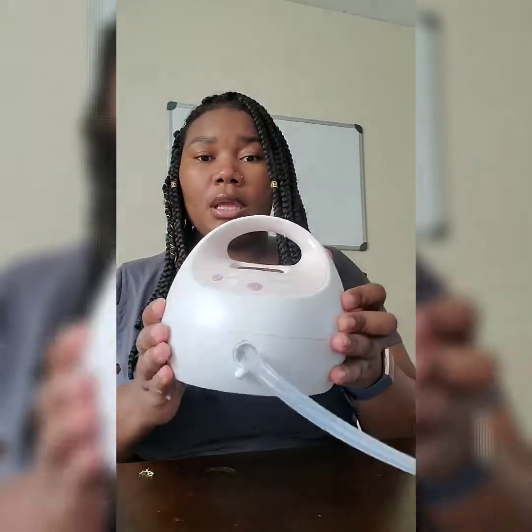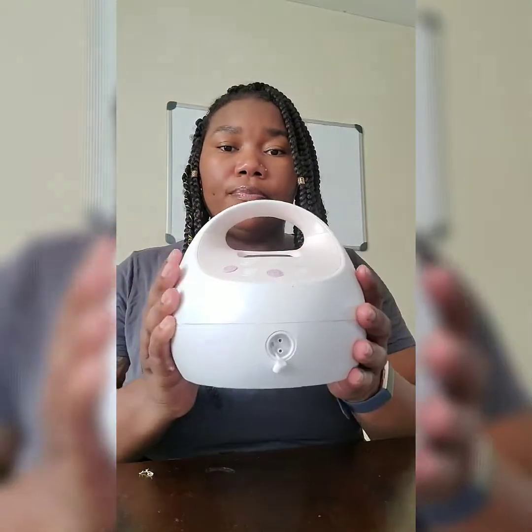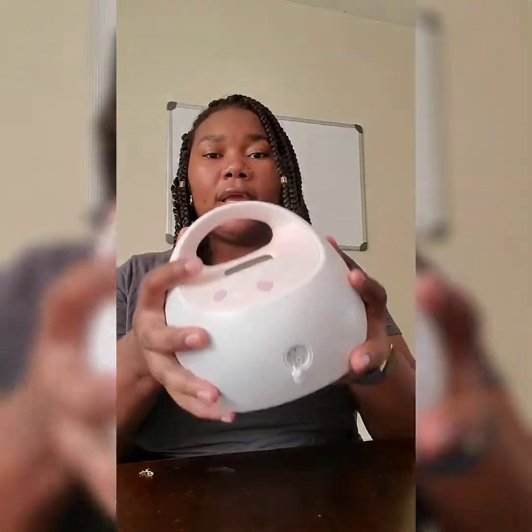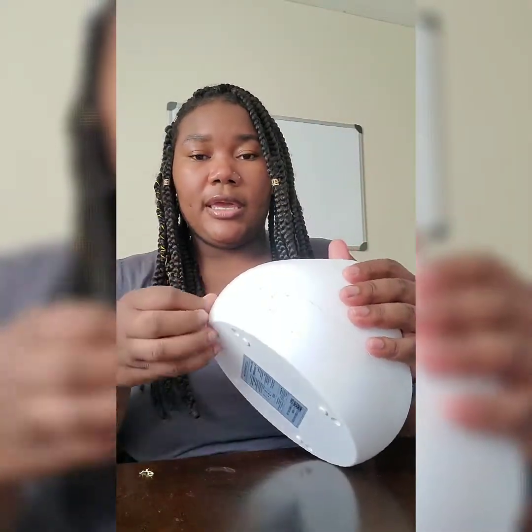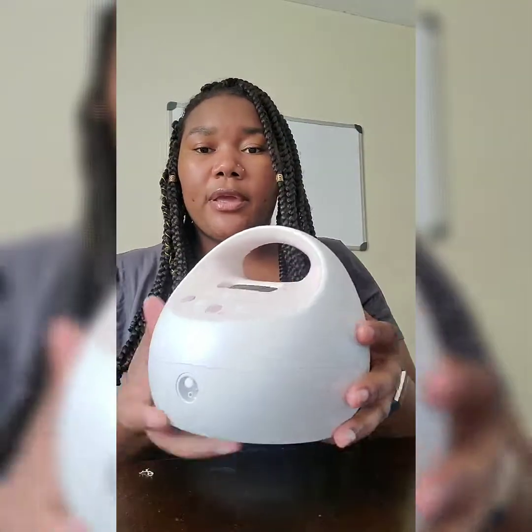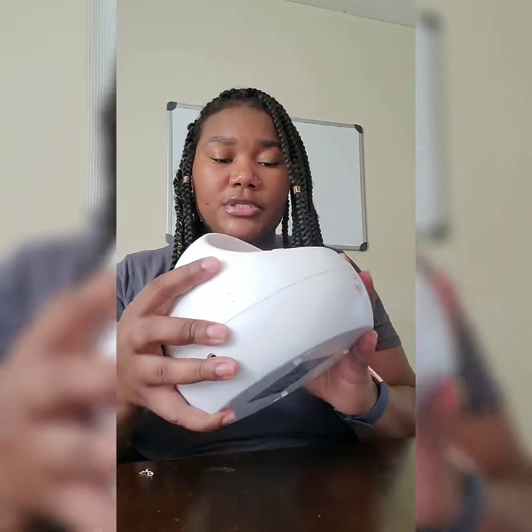So here is my pump — I'll take it apart real quick. It's really lightweight; a gallon of milk is heavier than this. This is my Spectra S2, and it's a very quiet pump.